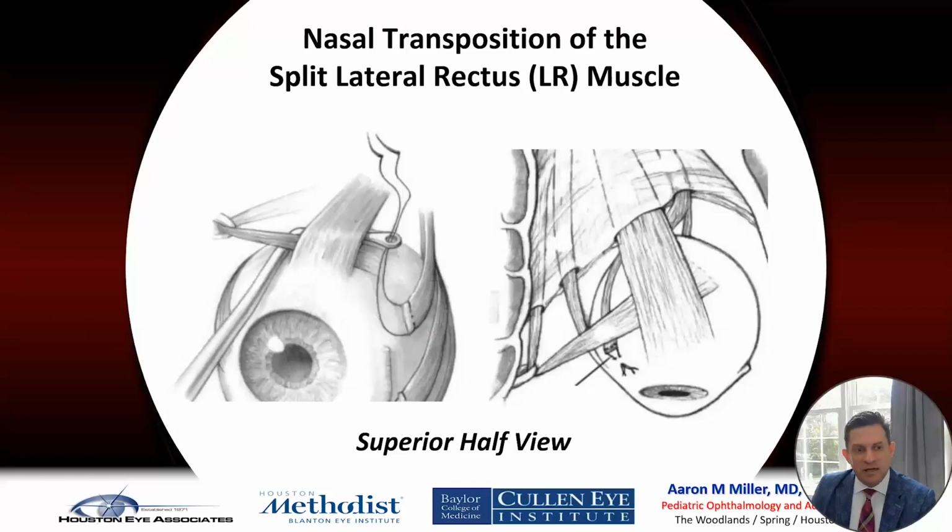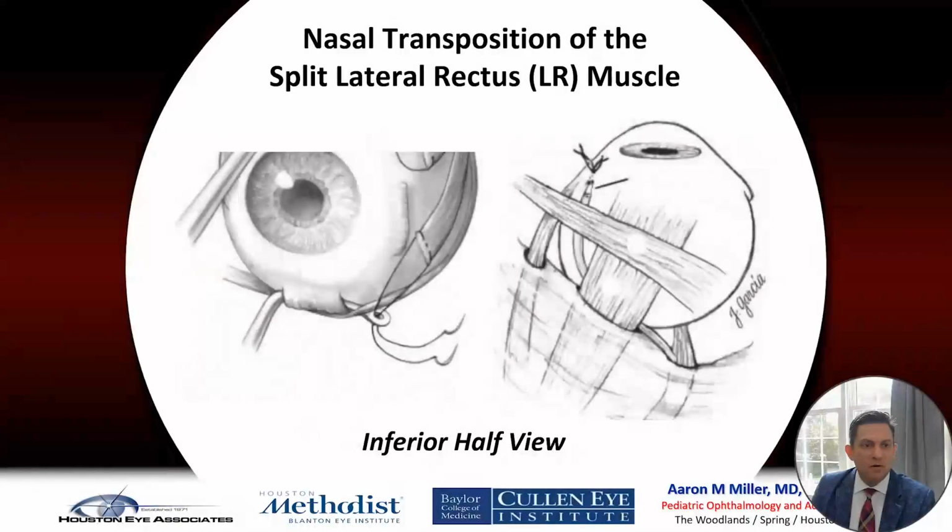One other thing that people that have done this procedure will talk about is how hard it is to advance that muscle up to the insertion on the medial side. A lot of it I find tends to be tied to the length of time that the individual has had this condition and how much contracture there is of that lateral rectus. The longer it has not been addressed, the more contracture and the more difficult it is to fully advance this muscle all the way forward.